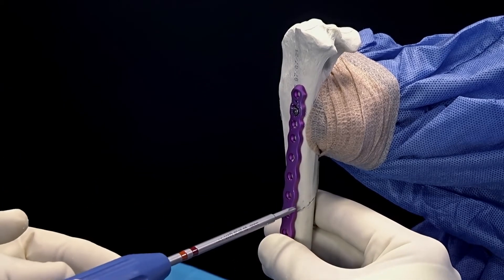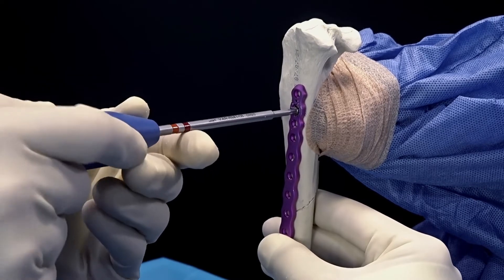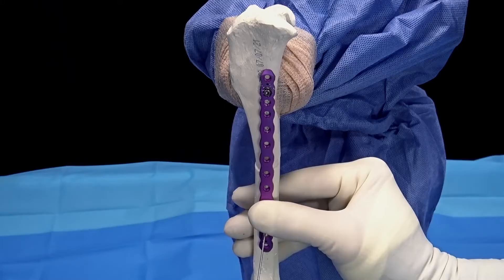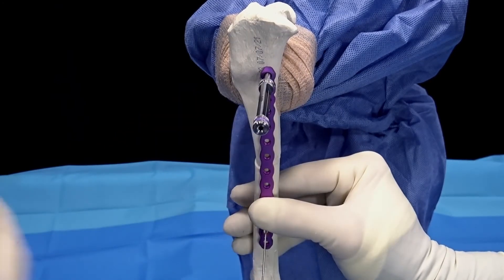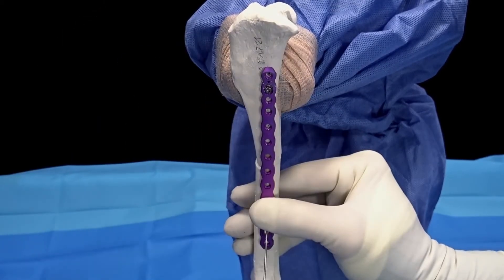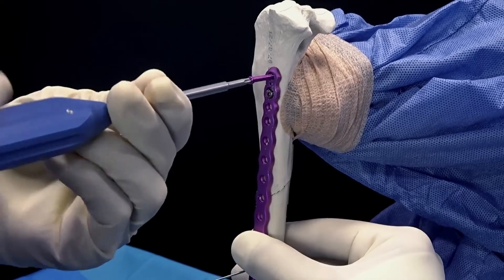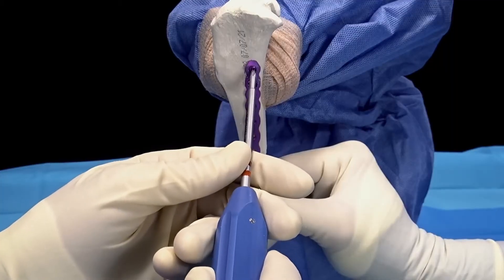Once we're happy with the placement of our plate relative to our fracture segment, we'll go ahead and tighten the cortical screw at the slide hole. Next, we'll apply a locking screw in any of the proximal holes using the locking drill guide. The locking screw in this case is magenta. The variable angle screw is a more golden color, which we'll apply later. The screw should be slightly recessed to the plate.